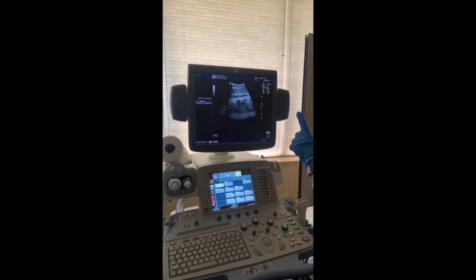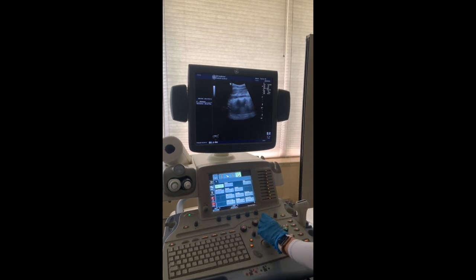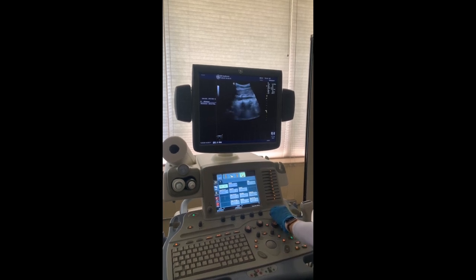Performing the aortic protocol, you will see a large vessel that is dark or sonolucent running horizontally across the screen. Here, you should adjust your depth and focus to the area of interest.